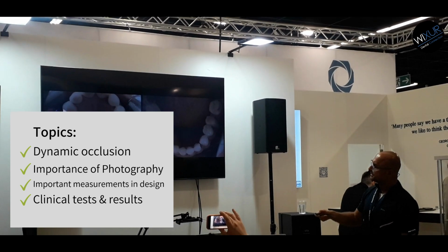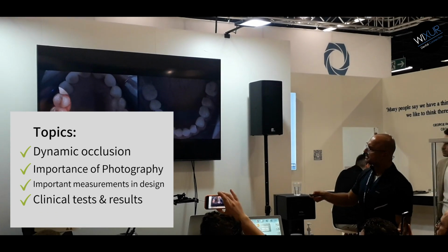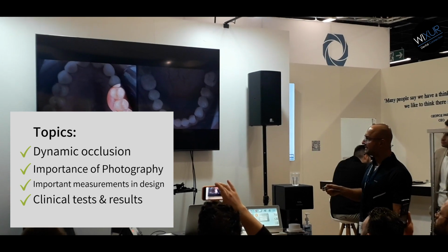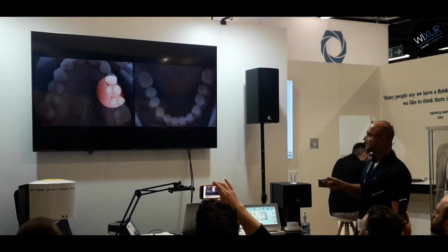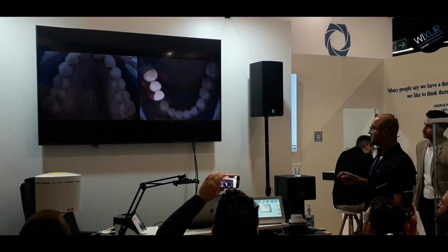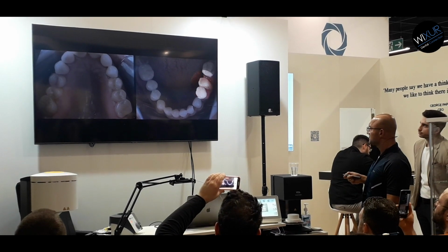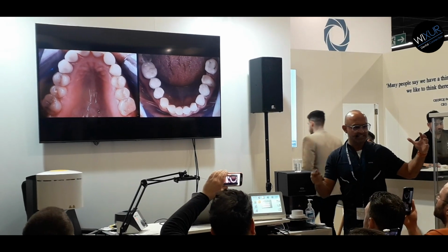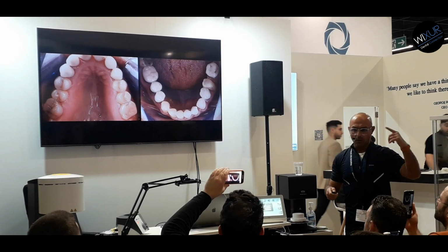You see the cuts are healthy, no big problems here. But on the other side, pay attention please, everything's flattened. Everything's flattened. When we look at the lower jaw, here, right side, everything's healthy, but on the left side we have some problems. Why is that? Why is the left side not really healthy and the right side is healthy? This opened the question for us.